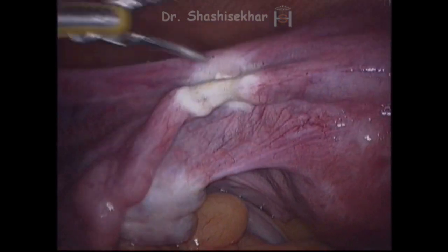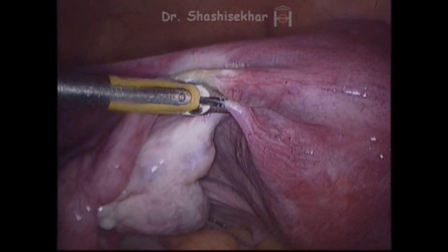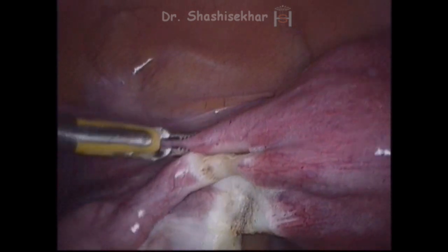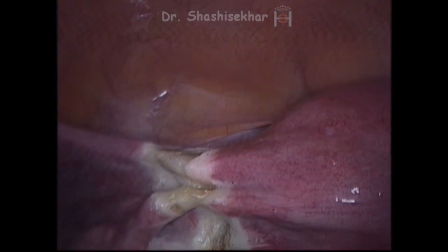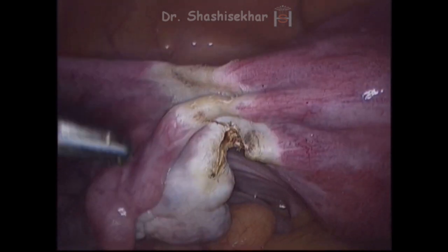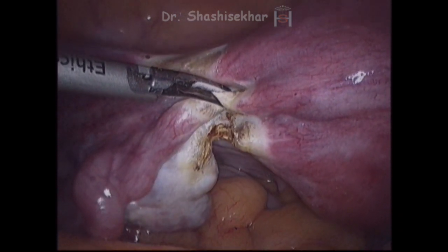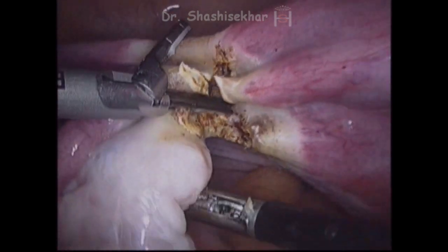The dissection has started on the left side. Bipolar cautery is being used. Initially the fallopian tube is cauterized, now the ovarian ligament, and finally the round ligament. There is no specific order in which you have to do things — it's your comfort. You can come from above downwards or below upwards, or start in the middle as is being done now. Initially it's cauterized and then a harmonic is being used. You can use other devices also — a harmonic directly, a ligasure, or an endo-seal. It depends upon your preference. All you need is effective hemostasis.